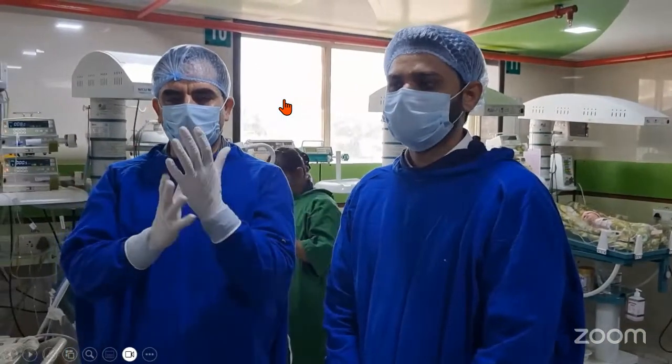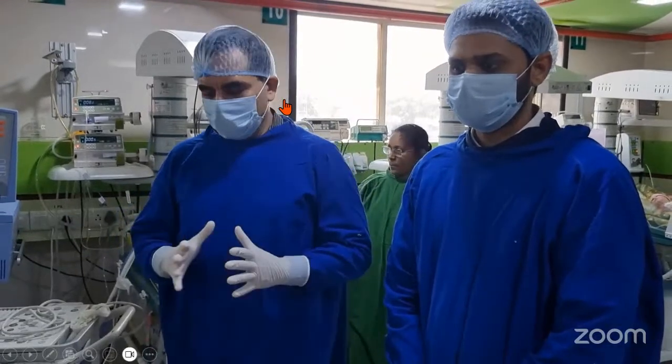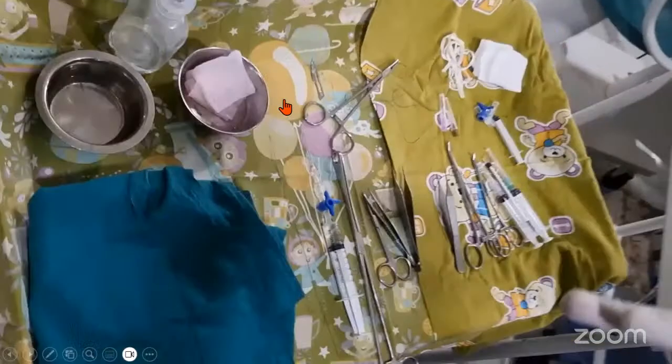Always have an assistant with you. Do the full surgical scrub, gowning, capping, and prepare the trays as you do for the central line insertion.